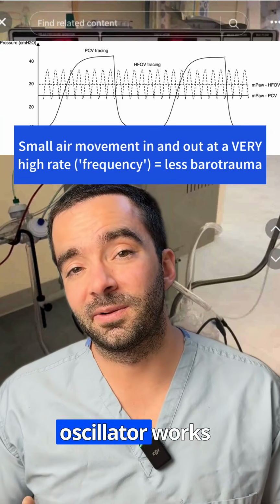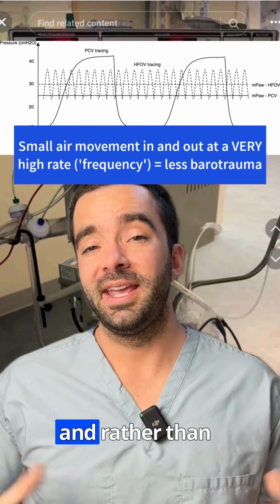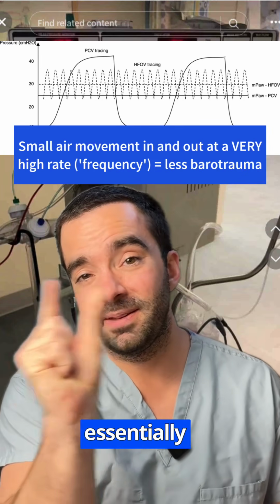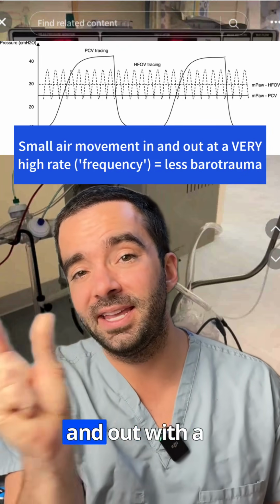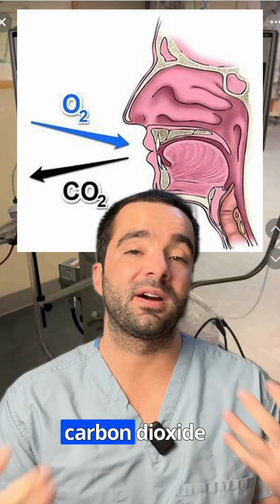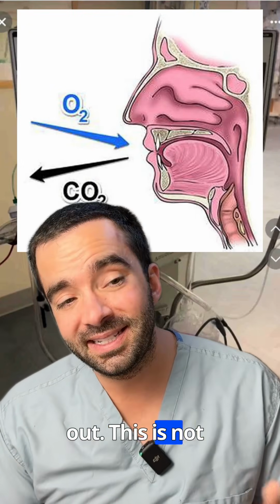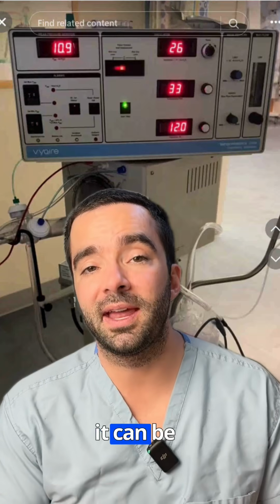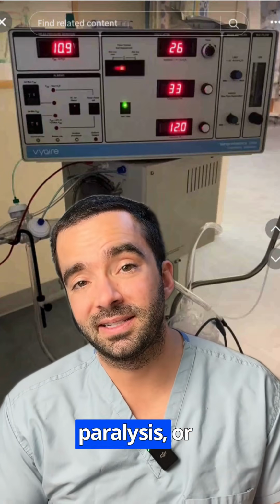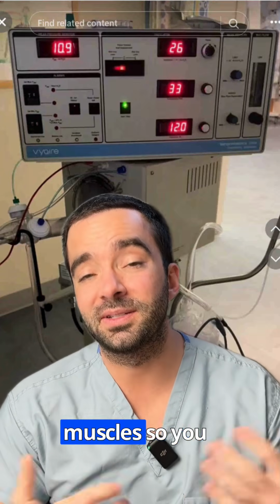So the way the oscillator works is you basically inflate the lungs, and rather than doing breaths a couple times a minute, it is essentially taking tiny amounts of air in and out with a piston and using that to get oxygen in and carbon dioxide out. This is not the way the babies are used to breathing, so it can be uncomfortable and often requires more sedation and sometimes even paralysis, or medicine that relaxes your muscles so you can tolerate it.